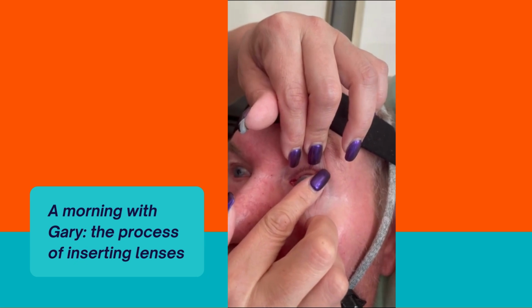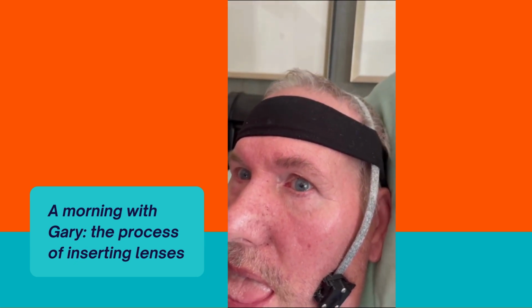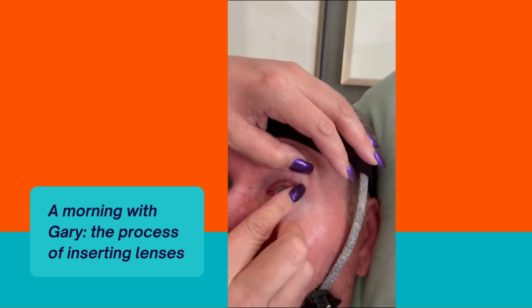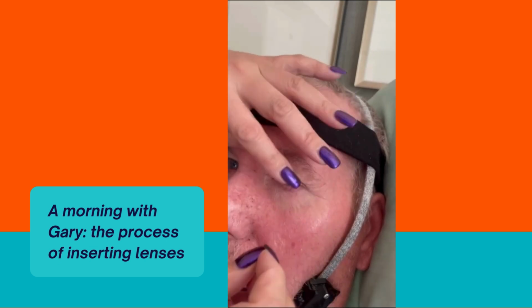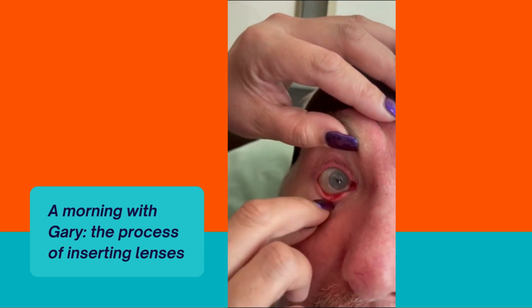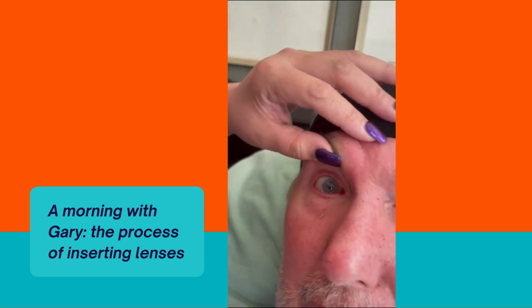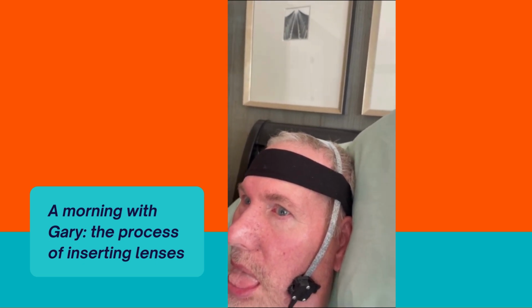You just touch it and spin it. But don't push hard, because if you push too hard, you push the liquid out. So you just lightly touch it. It's the lightest touch and a little bit of spin, like you're spinning the hands of a clock. And now the dots are at the top, the double square dot in that left eye. That was one thing we might have to do. She'll touch the other one, and his one dot is at the top on the right. The single dot is often a little harder to see because it's a little bit smaller.